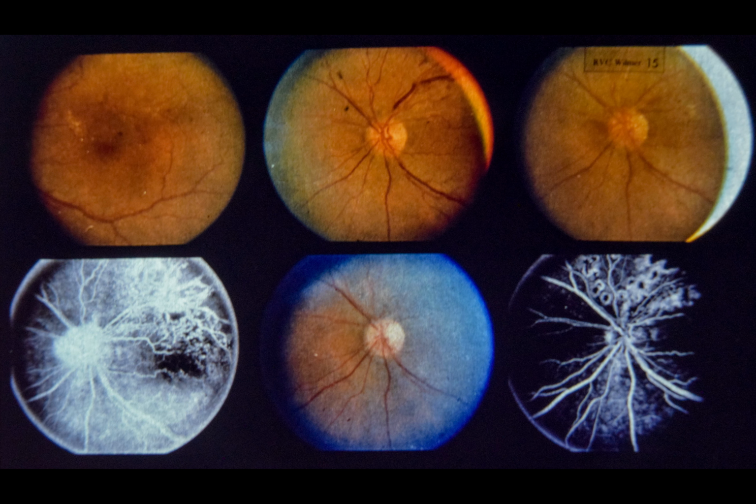Scatter-type argon laser photocoagulation was applied to the superior temporal quadrant to promote regression of disc neovascularization. Lower center, note absence of disc neovascularization 1 year after treatment. A small optociliary collateral vessel is seen on the superior aspect of the disc. Lower right, there is no dye leakage from the disc 1 year following treatment. Laser photocoagulation scars are seen above disc. Visual acuity gradually improved to 20/30 as macular edema was reabsorbed.